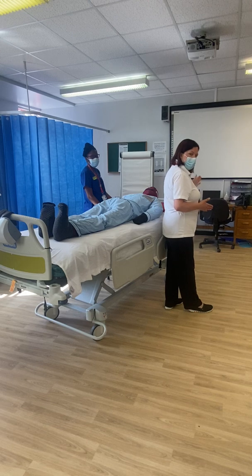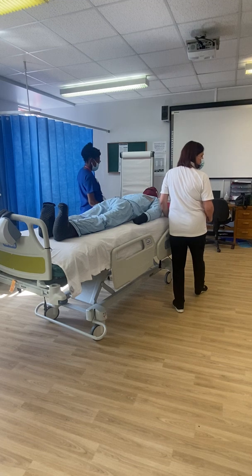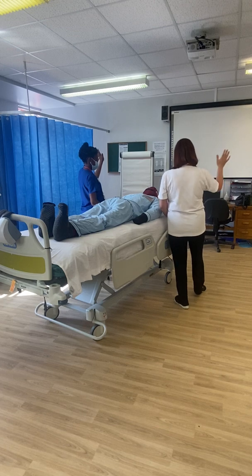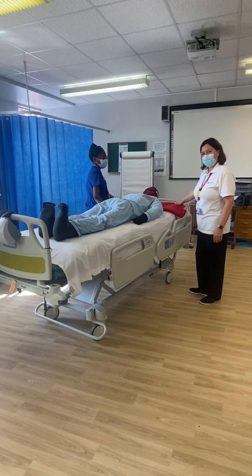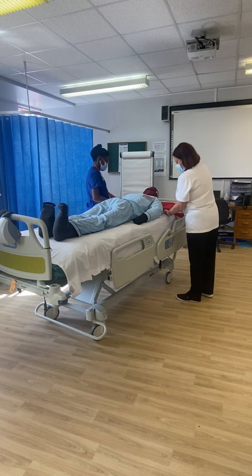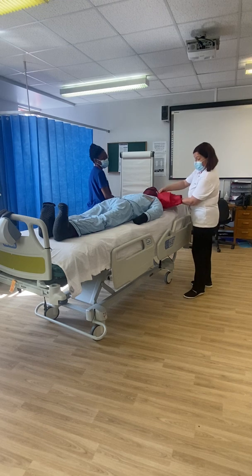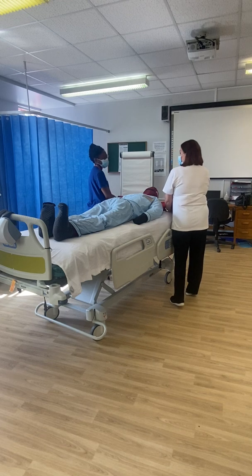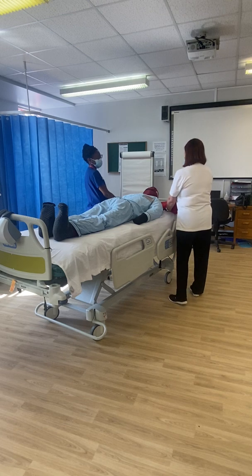Now, both members of staff now face the top end of the bed in a step stance position with your outer leg forward and your inner leg backwards. With your outer hand, so my right and Priscilla's left, you take hold of the open end of the slide sheet and hold it down against the bed. With your other hand, palm flat and facing upwards, you go underneath the whole of the slide sheet and grab the top of the fold, like that. And then on the command ready, steady, slide, we weight transfer backwards, and as we do so, this starts to unravel our sheet underneath our patient.